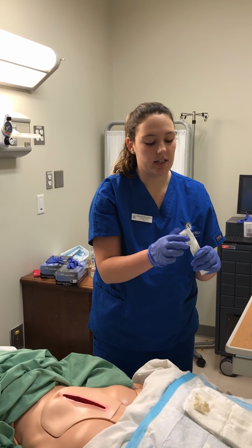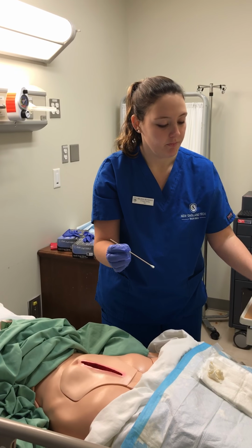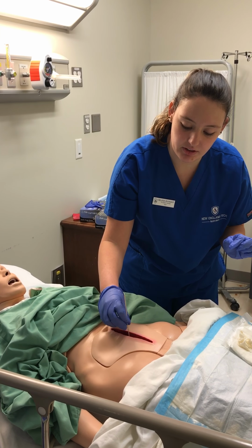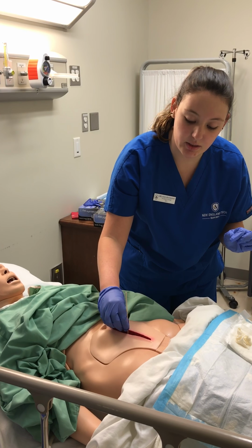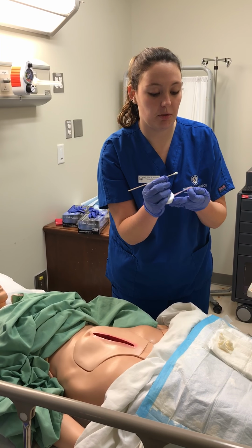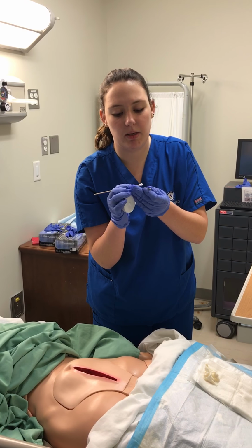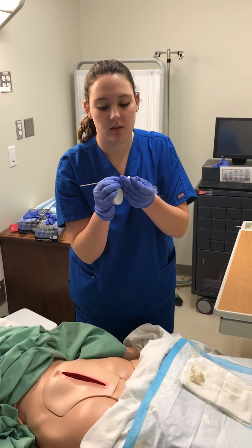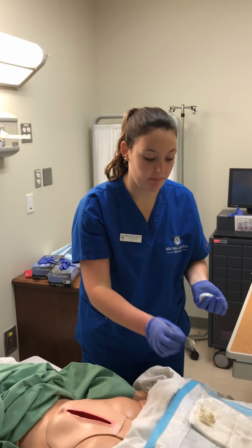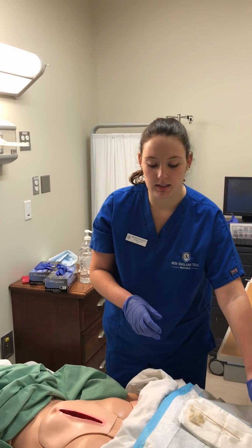Next, I'm going to measure the depth. I'm going to do so by using a cotton tipped swab. I'm going to go to the deepest area of the wound, and I'm going to slide my fingers down to where the skin once was. I'm going to pull up, and I'm going to measure where my fingers met, and it says about 2 3/4 of a centimeter deep. I would note these findings in his chart.